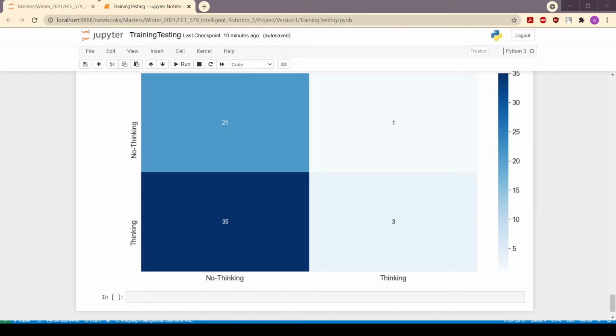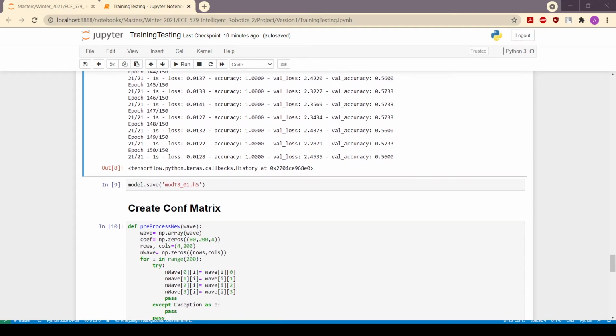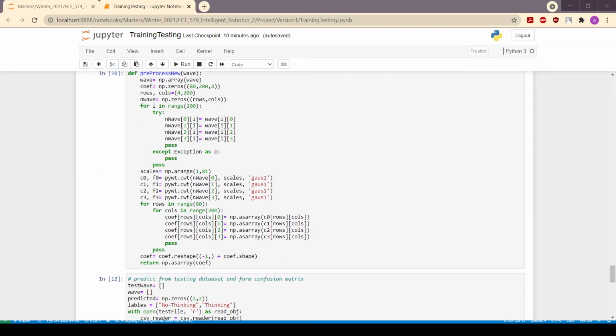So from this, there might be some issues. What I feel is that the pre-processing done here, I'm using PyWavelets for this continuous wavelet transformation, but I would suggest having a custom wavelet transformation as required. Another possibility might be the recording sessions. The recording sessions were quite long, each day about 10 to 15 minutes, and 10 to 15 minutes is fine.